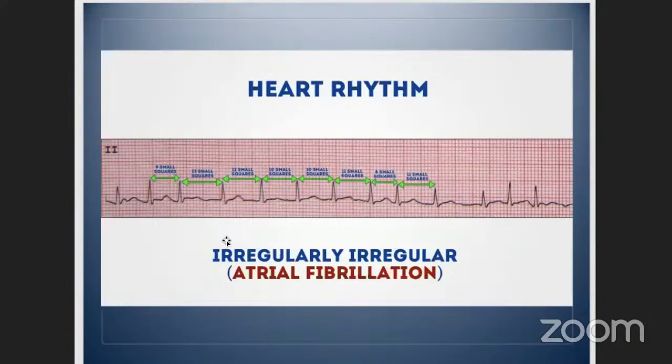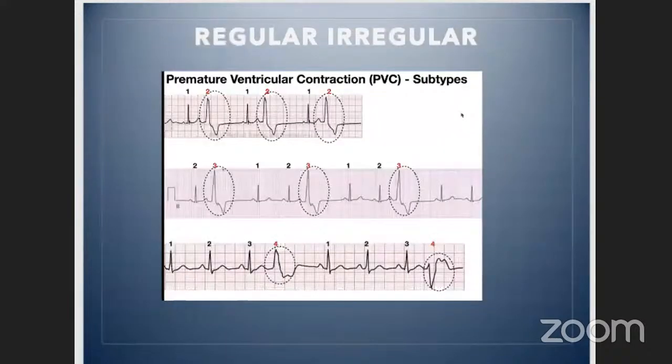The best way that we can assess this is what we call the line of 4. We take a separate piece of paper and draw 4 lines on that paper at each of the QRS complexes, and then shift that paper along. All of those complexes should still fall within those lines. That's the easiest way for us to assess rhythm and to determine if it is regular, a reliable test that is a lot more accurate than eyeballing it.